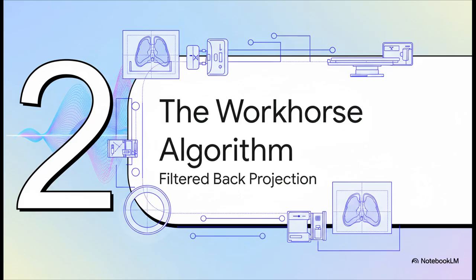Okay, let's fast forward to the 1970s. We've got the theory, right? But now the first actual CT scanners are being built, and the engineers have a problem. They need a fast, practical way to do this whole Radon thing in reverse. And the answer they came up with was this super elegant and computationally smart algorithm that became the absolute workhorse of the industry: filtered back projection, or FBP.